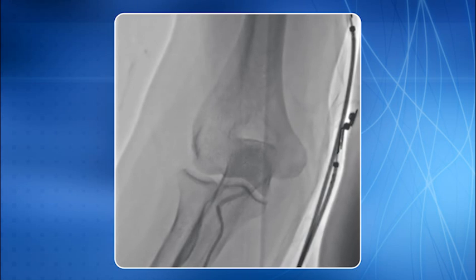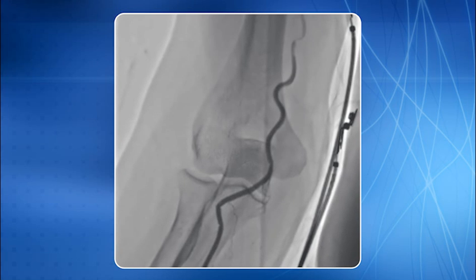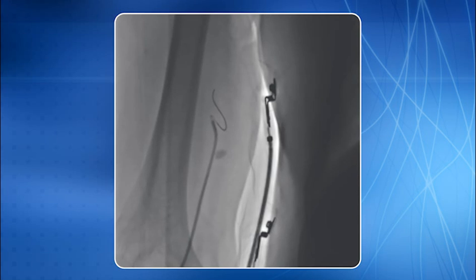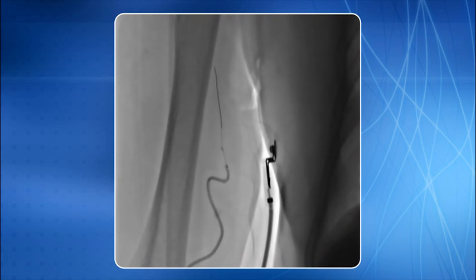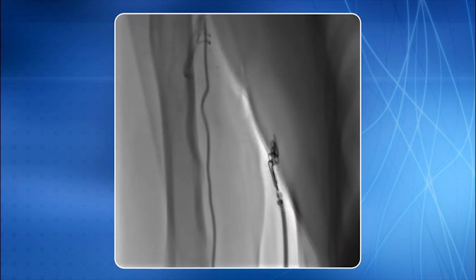Now, I will show you another example of anomalous radial artery arising from axillary artery, having small caliber, atherosclerotic lesion and a sharp hairpin loop in the brachial region. Catheter over a PTCA wire refused to cross the hairpin loop. Balloon is brought in the proximal segment. Now, balloon assisted tracking was used to cross the loop successfully. While coming back, angiogram documented no damage or razor effect to the radial artery.